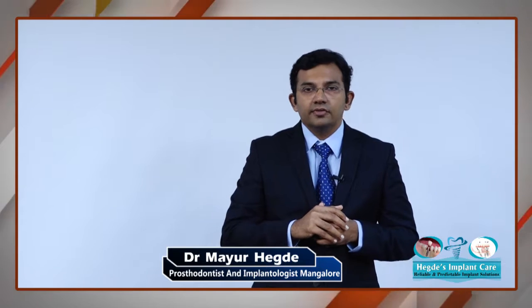To start with, the first appointment would be the surgical appointment, the placement of the dental implant. Suppose, for example, I have a molar missing, I have to place the implant in that particular area today, which probably takes about half an hour. We place the implant, we suture it back, and the patient can go back home. Of course, suture removal is there.